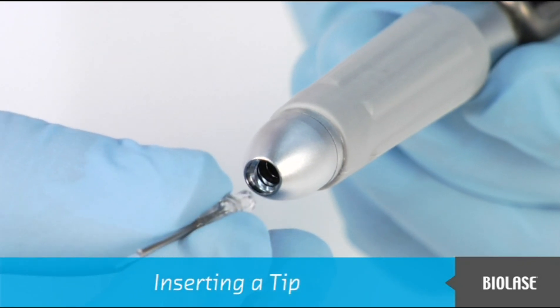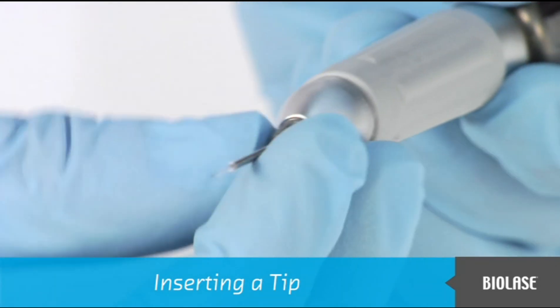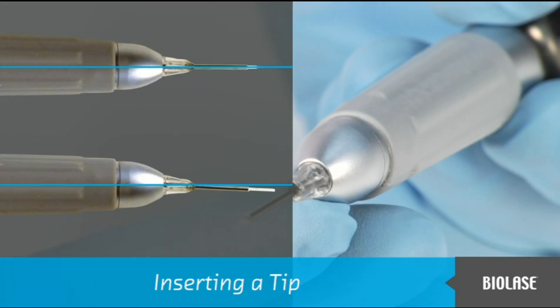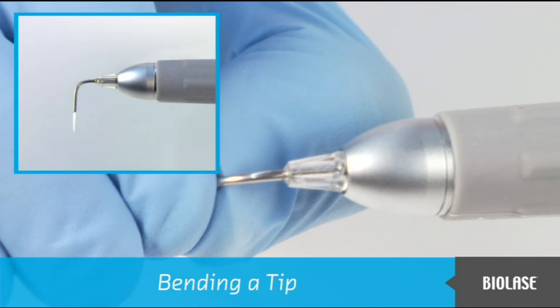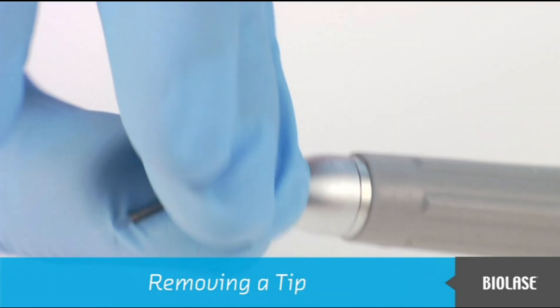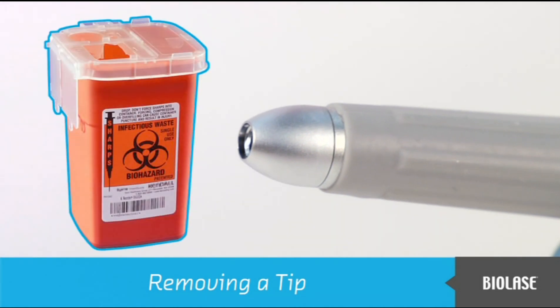Insert the tip into the open end of the cover and turn clockwise to tighten it. Make sure the tip extends straight from the cover. If it is angled, remove and reinstall the tip until it is straight. Once properly installed, you may bend the tip as desired, but be careful not to make too sharp of an angle. When the procedure is finished, remove the tip and dispose of it in a biohazard sharps container. Reuse of tips will result in reduced laser performance and may damage the fiber or laser system.